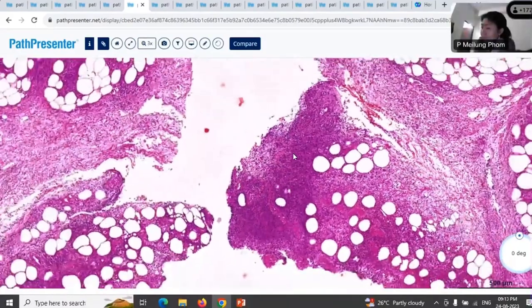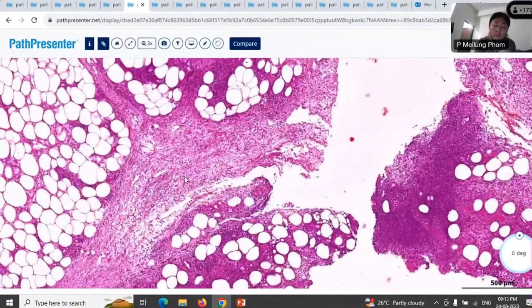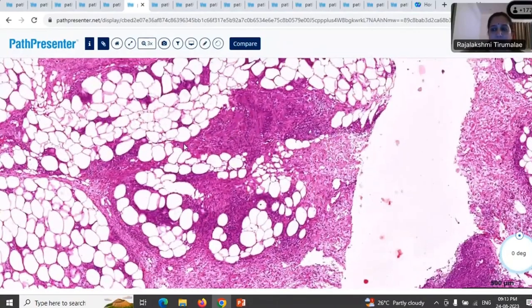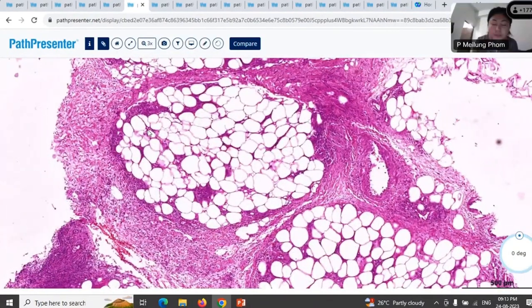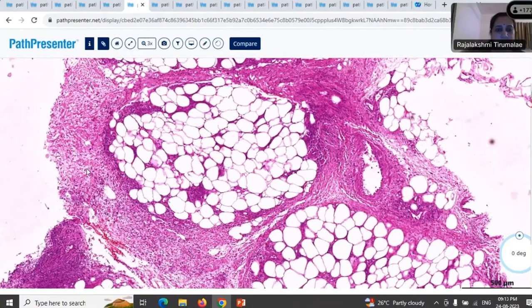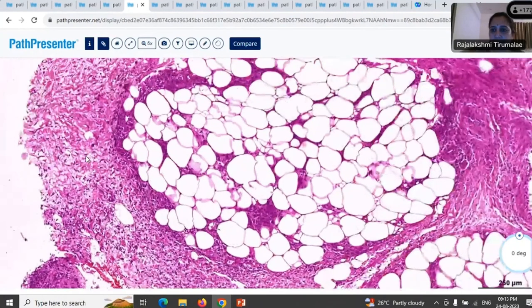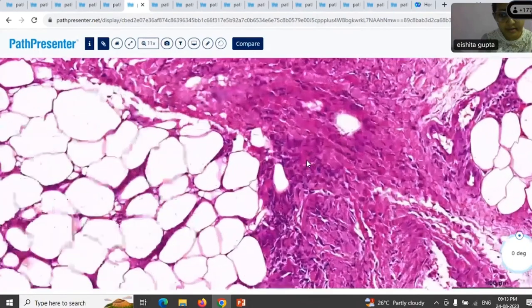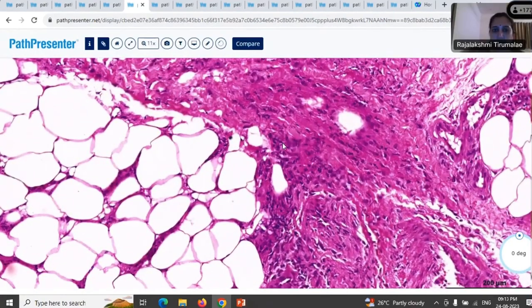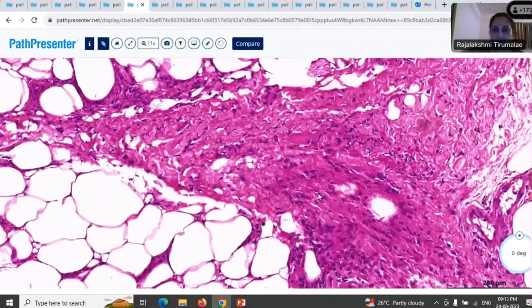So you said there are lymphocytes and there are macrophages. We'll come to the macrophages a little later. The macrophages are not in the septae. It's mostly lymphocytes. There is some edema here, so septal widening because of edema. And over here, there is some fibrosis. Yes, fibrosis, right?